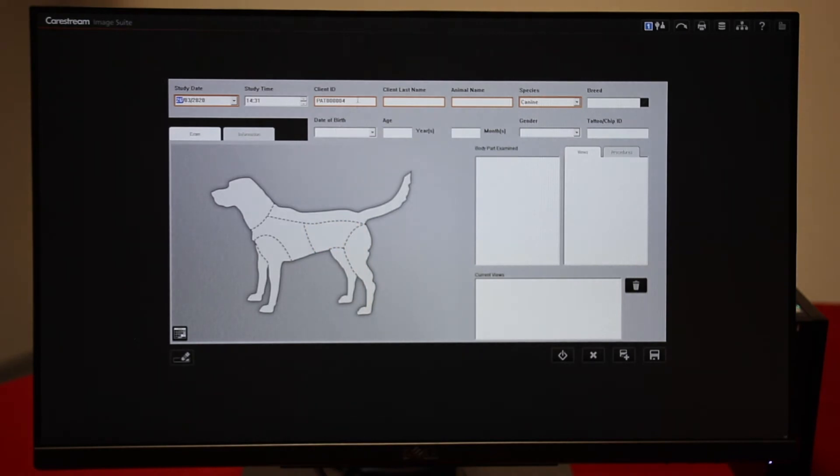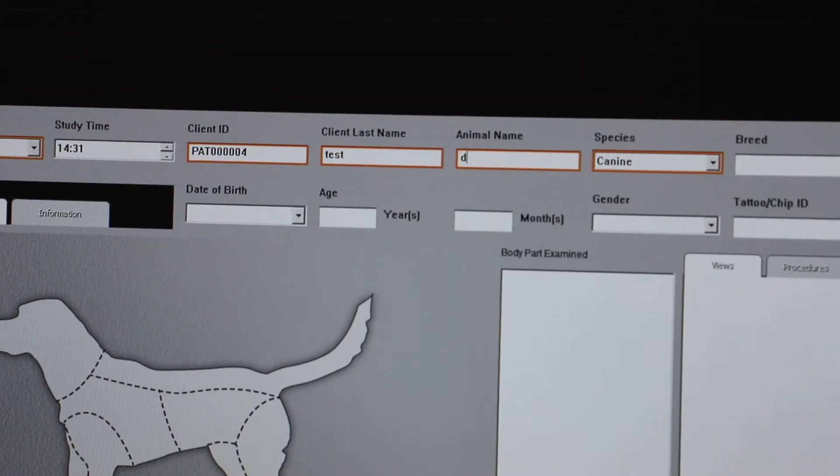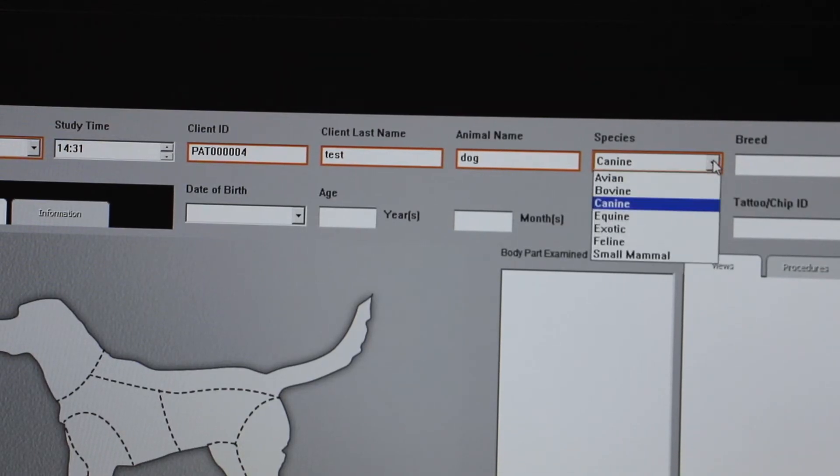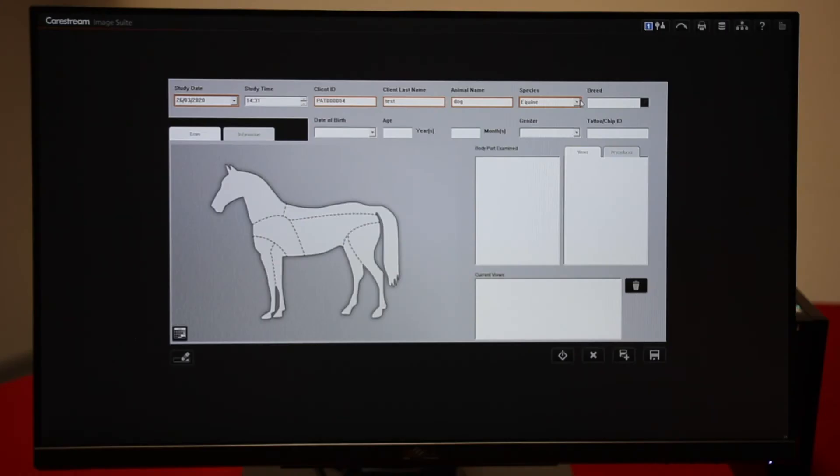You'll need a patient ID which is auto-generated but this can be changed to your own patient ID. We also need an owner surname and an animal name. Then pick the species we're interested in.